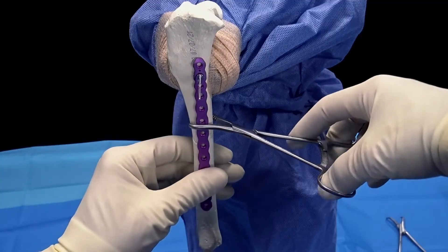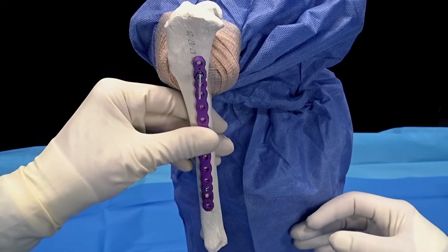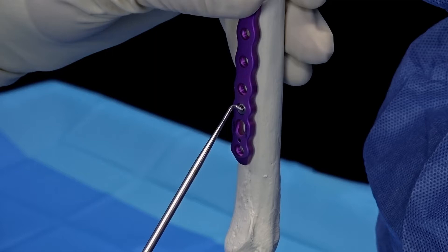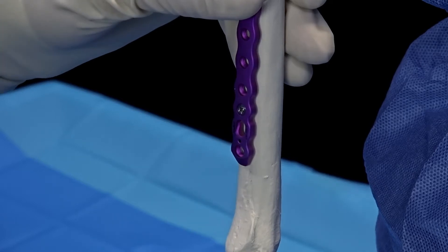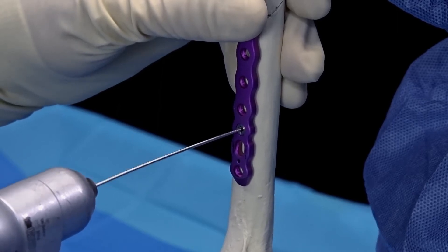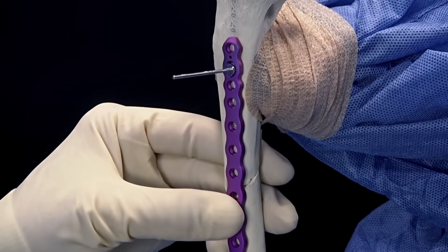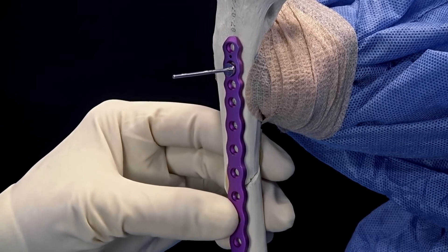Next we'll go ahead and remove our clamp, and we'll use a form of secondary fixation for the distal aspect of the plate. We have several options: we can put a BB-TAC in, we can use a K-wire hole, or a cannulated bending plug. This bending plug has a screw cannulation and we're going to place a K-wire into it. Unicortical placement of the K-wire secures the plate to the bone. Following placement of the BB-TAC, the plate can be adjusted distally to proximally to allow for alignment of the plate holes at the fracture gap.